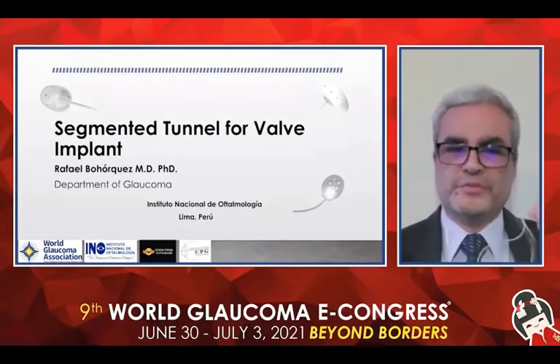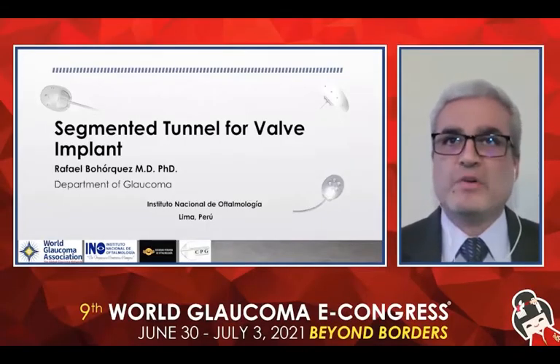We will talk about the surgical technique for the implantation of glaucoma drainage devices, which I have called segmented tunnel.